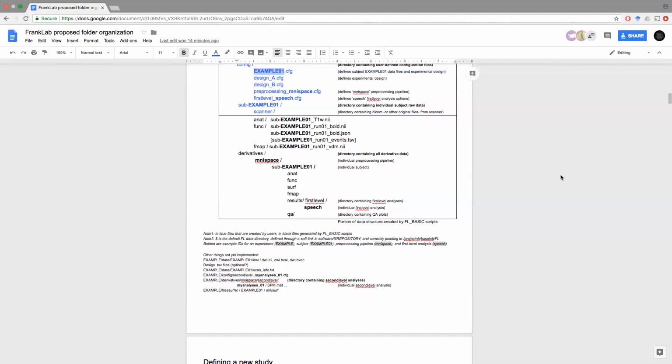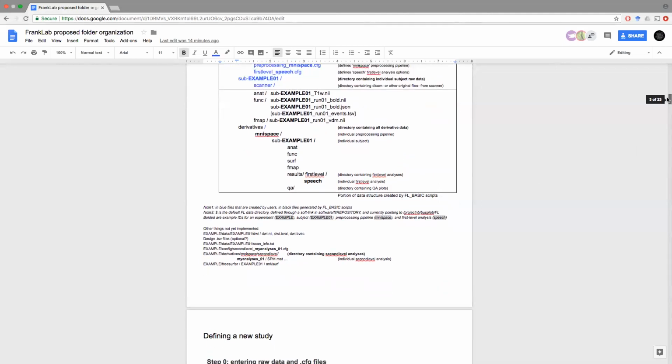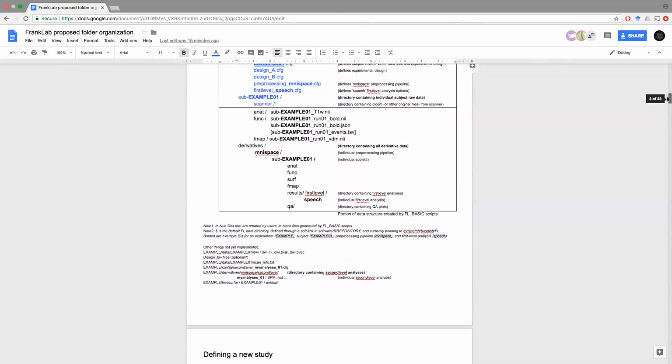Alfonso, can I jump in for a sec? Yeah, please go. So when you say you can use one or the other of those two volumes, have you looked into what's best to use? When these are used for co-registration, does having the skull or not matter?